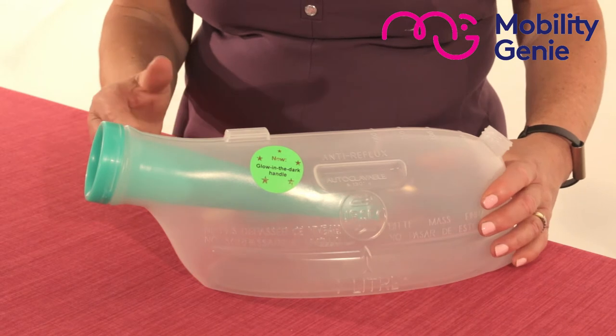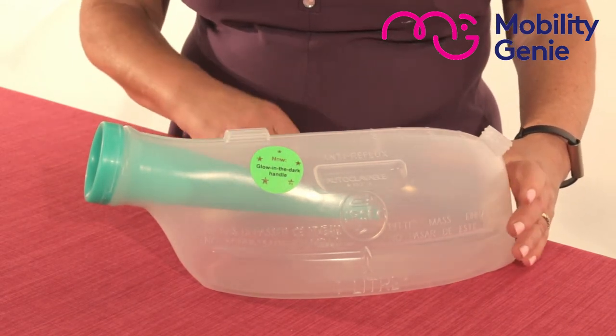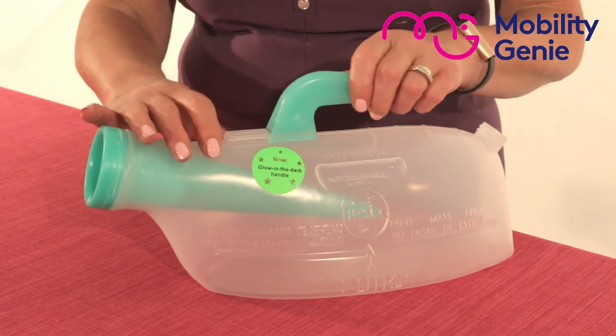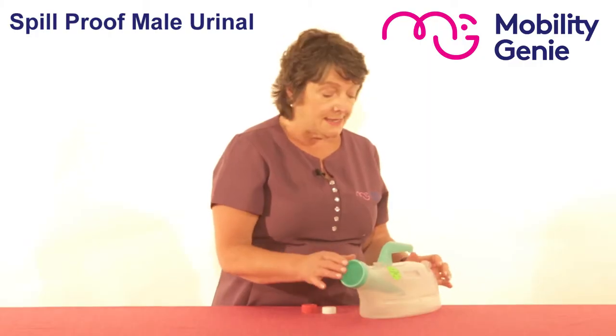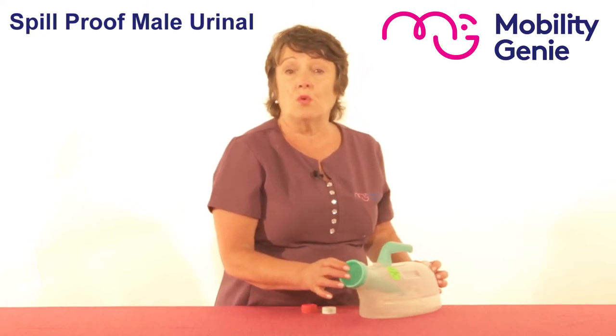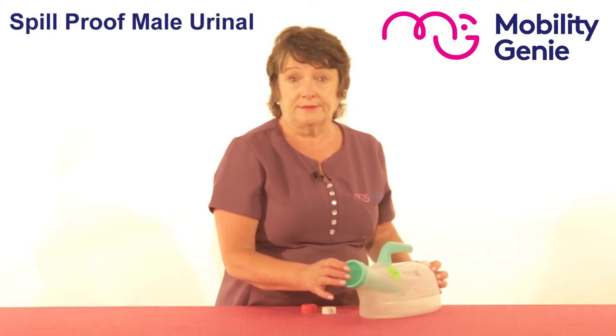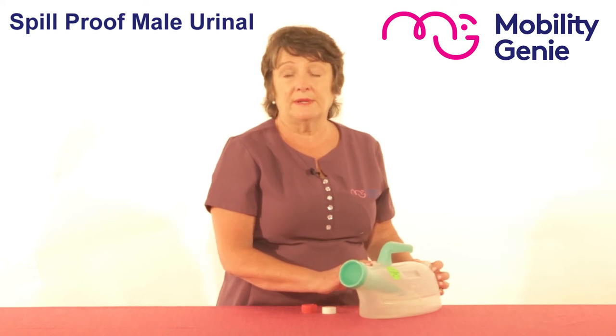The neck is angled in a way that allows for easy use, and it has a removable handle that allows for easy cleaning. It has a capacity of one litre, and it's very important not to go over that one litre in order to allow the spill-proof feature to be effective. For further information, please refer back to the page.